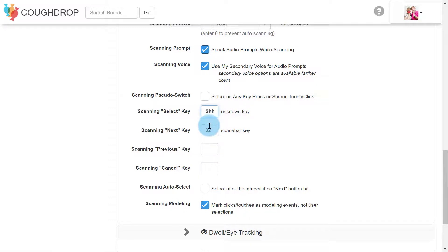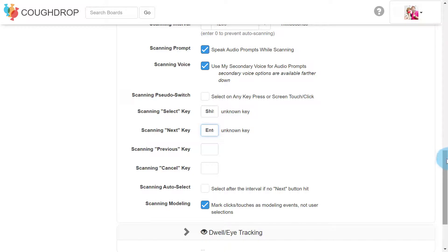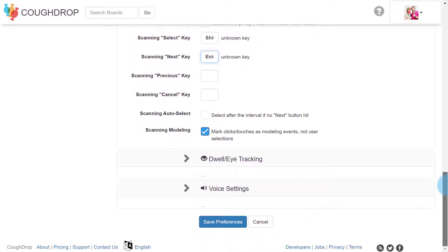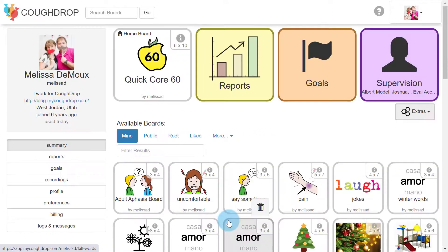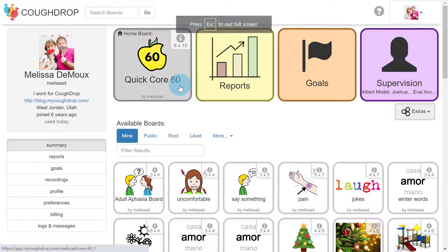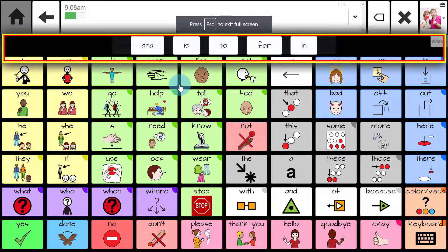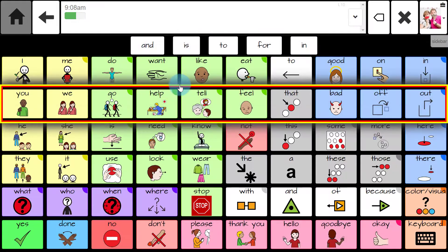Set the cursor into the box next to the desired function, then press the connected switch or keyboard button you want to perform that function. This will assign that switch or keyboard button to perform that task. You will see affiliated characters appear in the box indicating the connection has been made. Once you have input your chosen switch buttons or keys, be sure to save the preferences at the bottom of the page so that CoughDrop will remember your chosen settings.